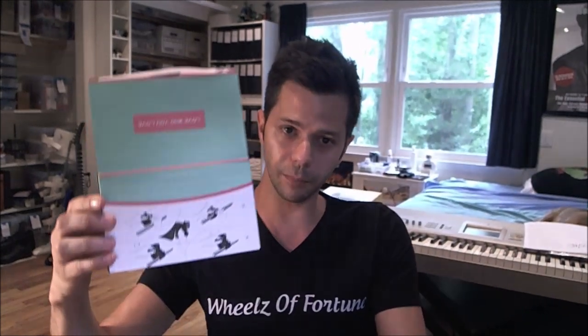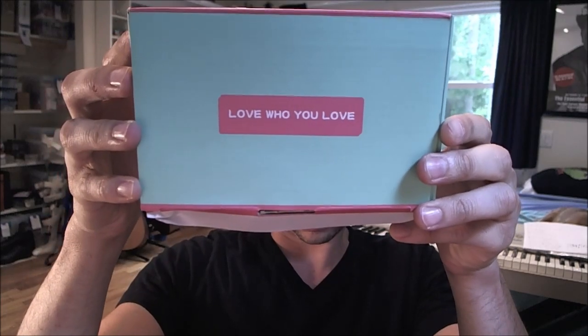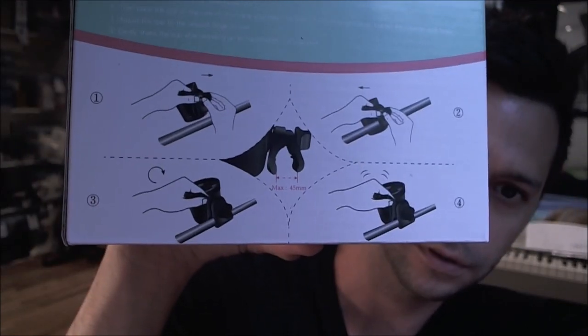I want to show you this is the box that it came in. Here's the front of the box — cup holder — top of the box, and then on the back there's instructions on how to put it on, if you can sort of see that.